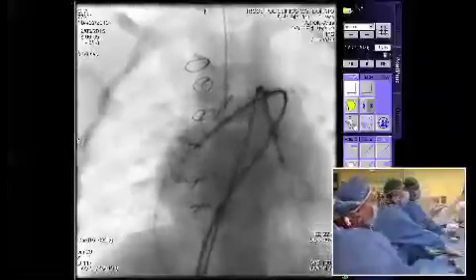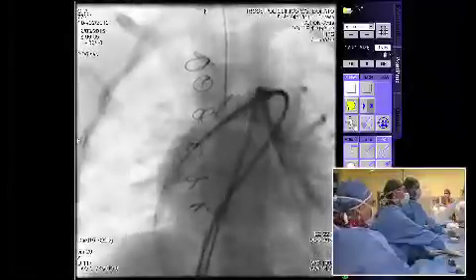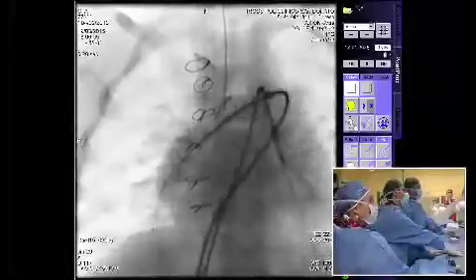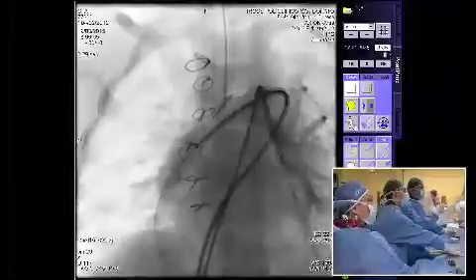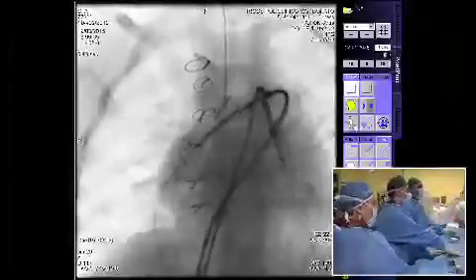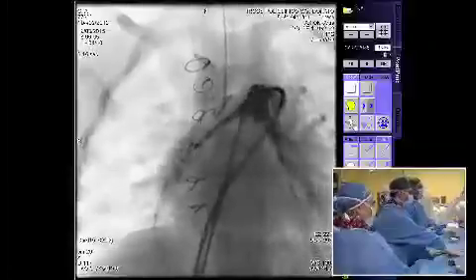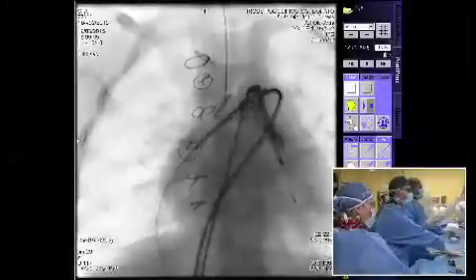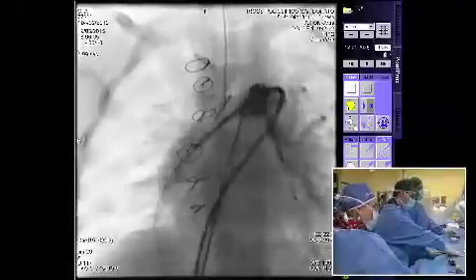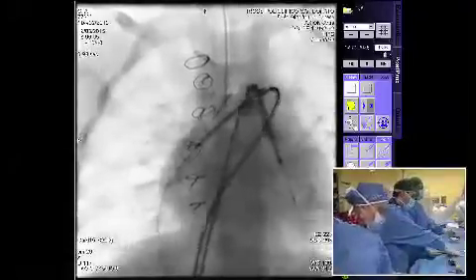As you may see, there is no regurg, and the pulmonary valve was not touched in this case. You see the test angio for the right PA. I should go in this position for the right PA, and then I would work on the left soon after the right is dilated.